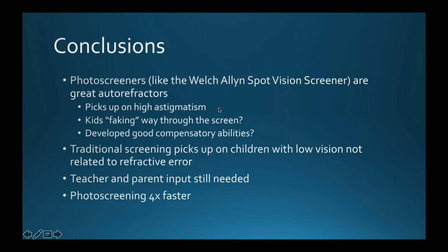You have to look at a target for just a few seconds and grab that picture. That's why we can do this in children as young as 1 year of age, and sometimes even 6 months old.